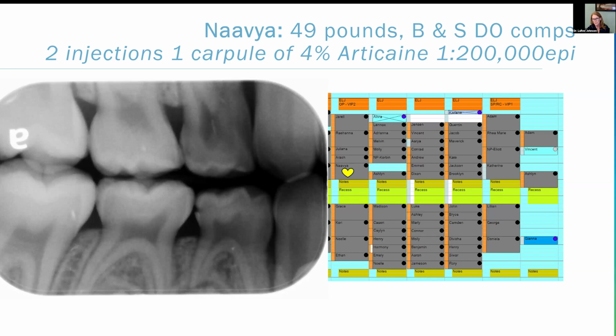In this situation, I can 100% tell you going into this, I knew the mandible was going to be easier. And I knew the maxilla was going to be more challenging based on the opacity of the crest. So you see how, especially right here, this is glorious. This is not very well organized. You're going to drop in there and it's going to be great. Little denser up here, but we still got in and we did very well.